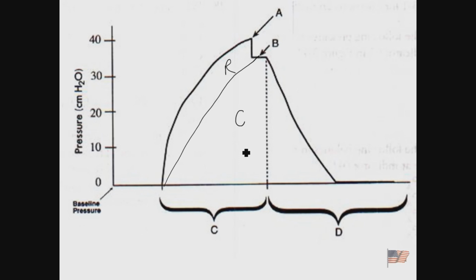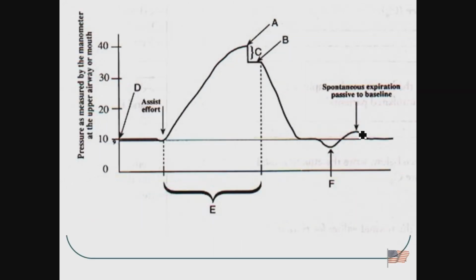Okay? And then this is the expiratory phase here. Here we end up having a patient who's triggering a mandatory breath. They happen to have a pause for whatever reason built into it. So remember, this is still part of the inspiratory phase. The expiratory phase doesn't begin until the expiratory flow starts to happen. And we also have a spontaneous breath that's interspersed there, so this would be which mode? SIMV. Great.